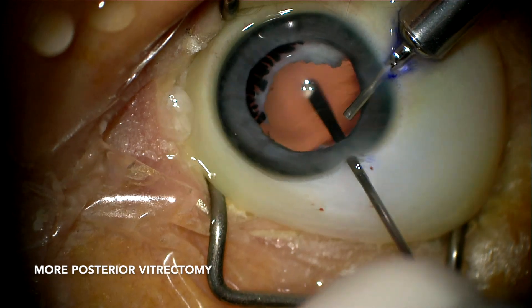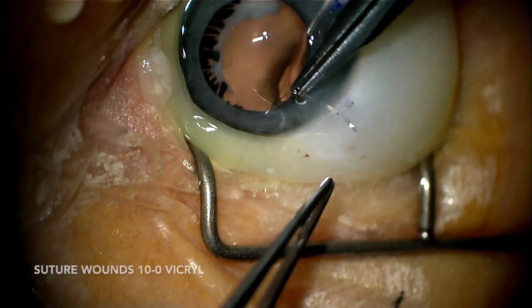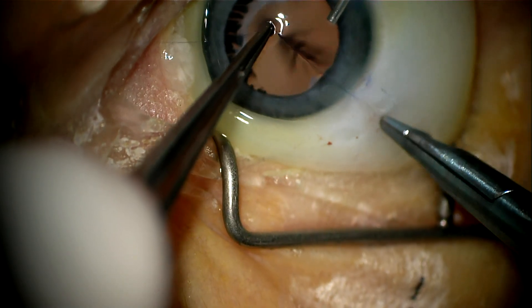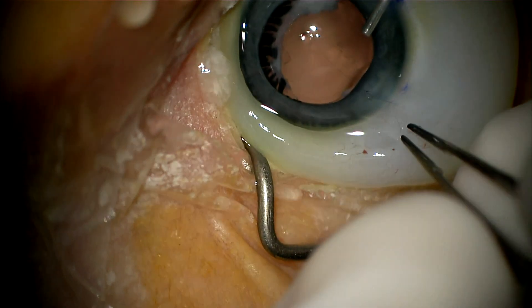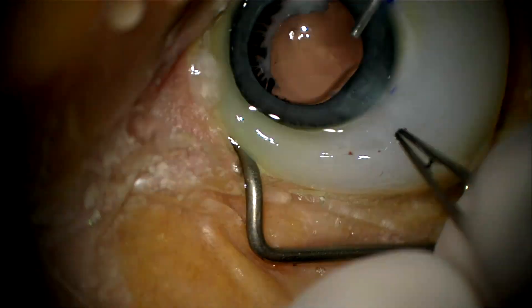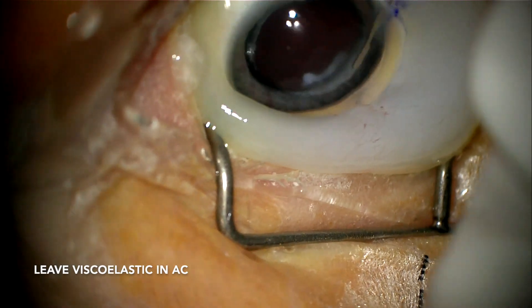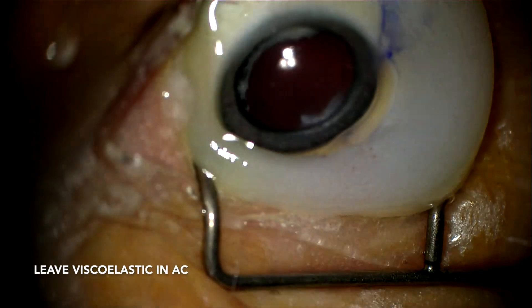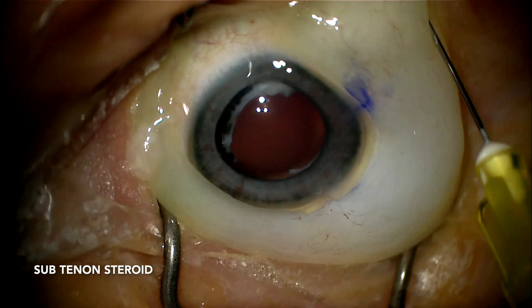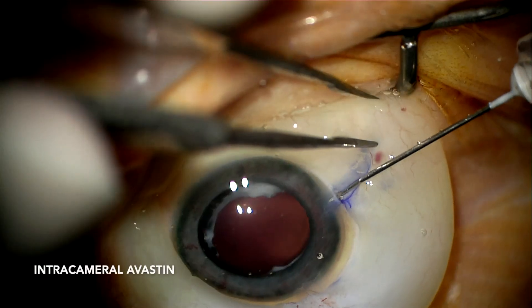The wounds are sutured with 10-0 Vicryl suture. Viscoelastic is used to help rotate the knots. Subtenon Triesence is placed. Viscoelastic is left inside the anterior chamber to maintain depth. Subconjunctival antibiotics are used, as well as intracameral Avastin, to prevent membrane growth and bleeding.